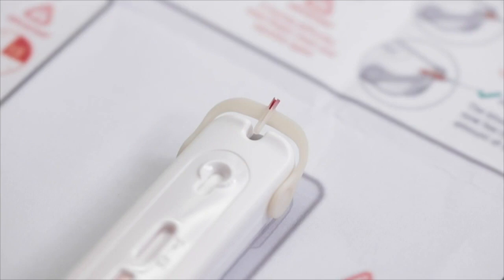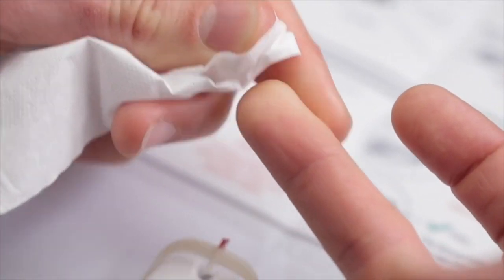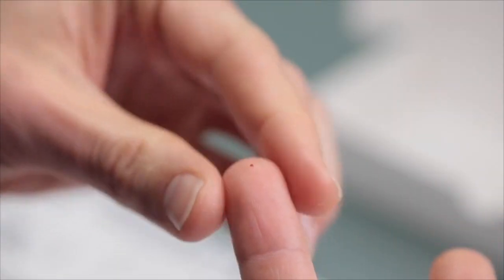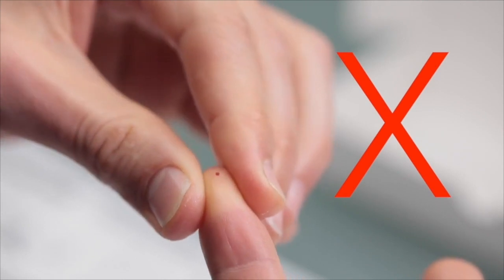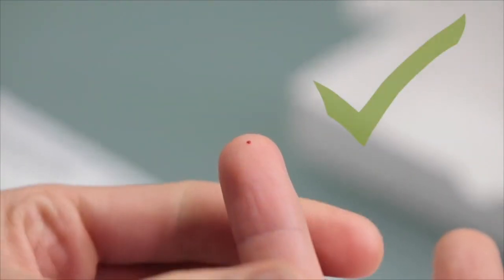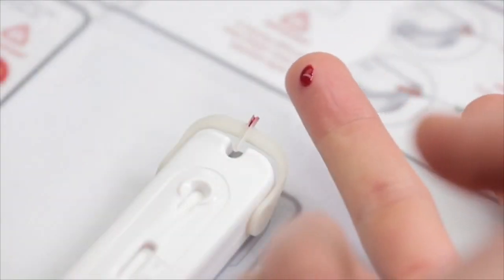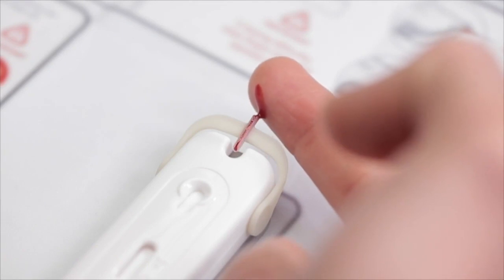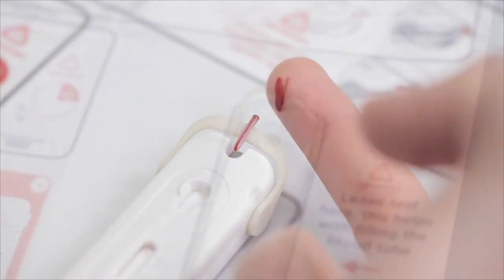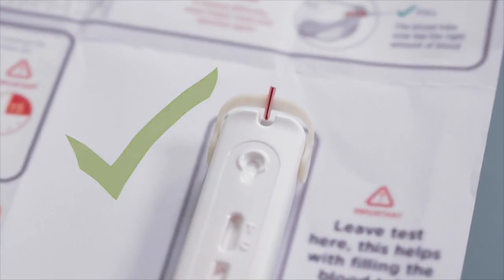If you are having trouble filling the tube or blood has smeared on your finger, take a moment and wipe your finger clean. Do not pinch your finger in front or to the side of the prick site, as this will reduce blood flow. Instead, make sure you firmly squeeze your finger behind the prick site to get more blood and touch the blood to the tip of the tube. It is important that the tube is full. If necessary, repeat until it is full. This will ensure that the test has the correct amount of blood.